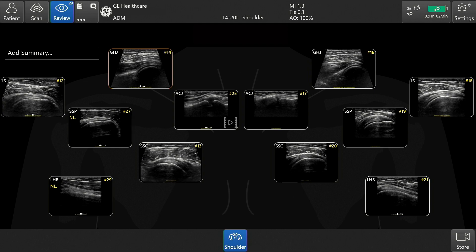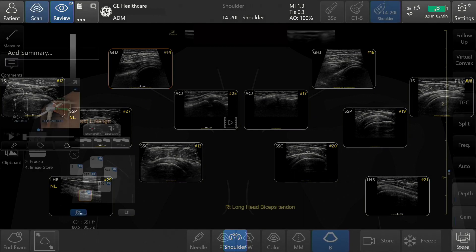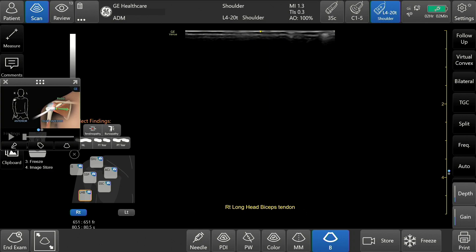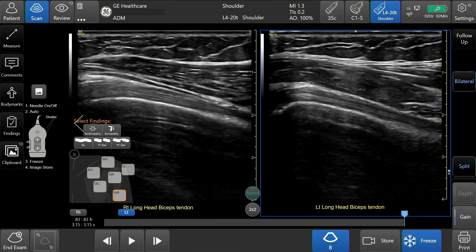Both shoulders in one view. Bilateral is available when using the shoulder diagram and reference image. Bilateral mode allows comparison of the same zone. To activate, tap bilateral, which is located on the right side of the screen. The screen splits and the live side of the screen is highlighted with a blue frame. When scanning the right shoulder, the active scan is displayed on the right side of the screen and vice versa.